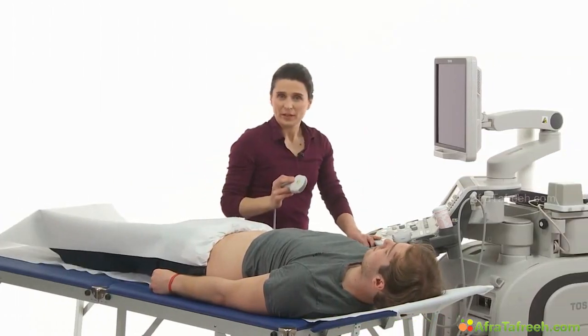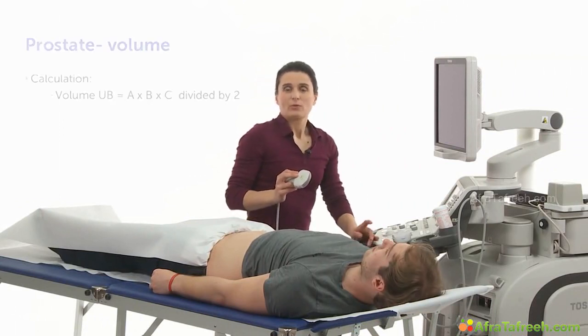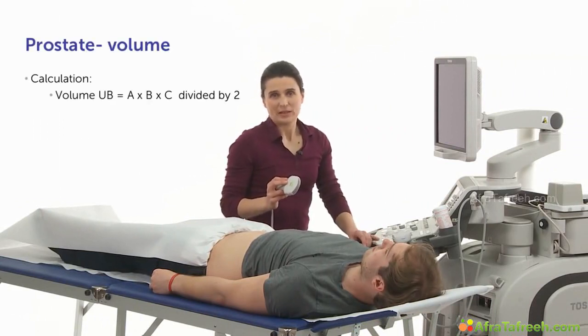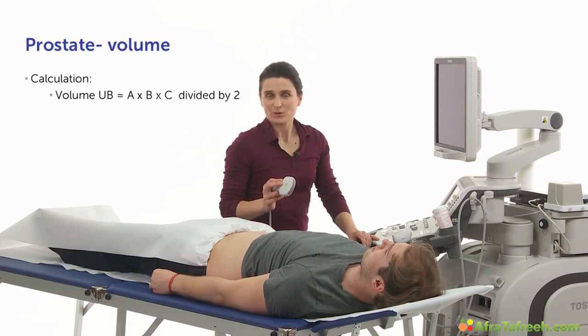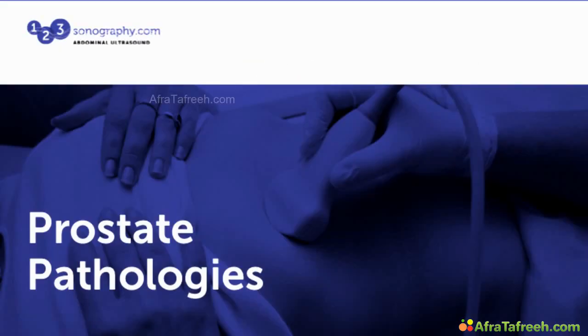We can also calculate the volume of the prostate. We already know how to do it. It's our formula diameter A multiplied by diameter B multiplied by diameter C divided by 2. And this volume of the prostate should be under 25 milliliters. We proceed to the pathologies of the prostate.